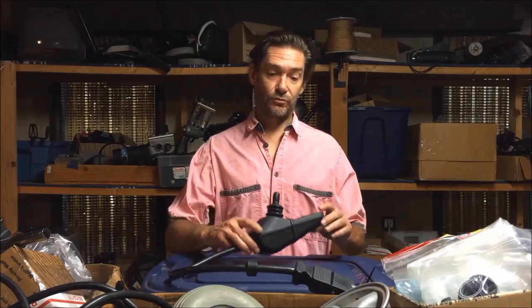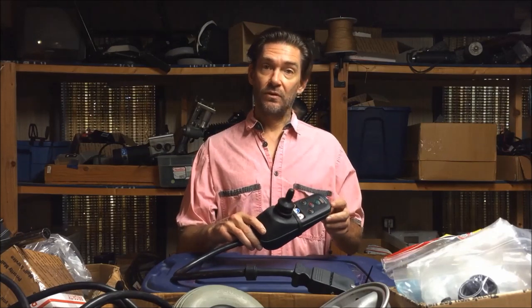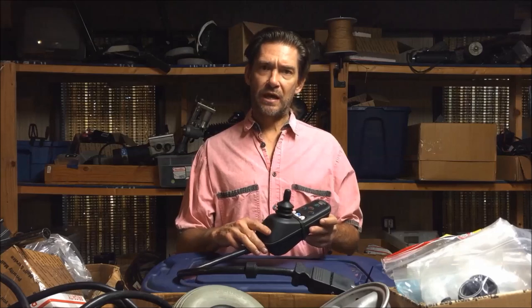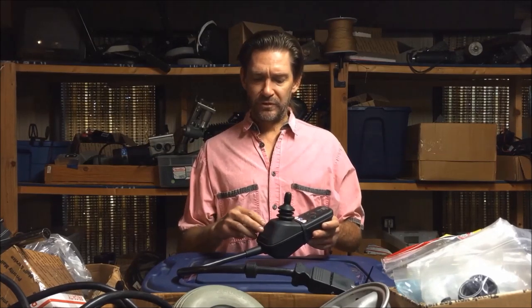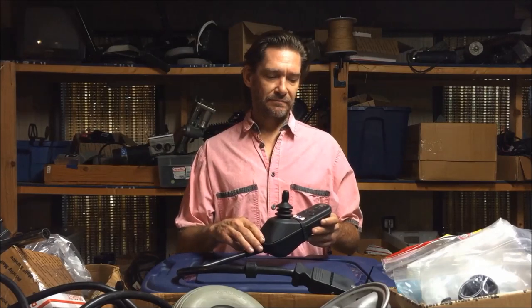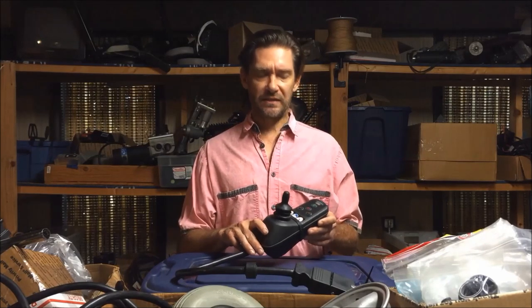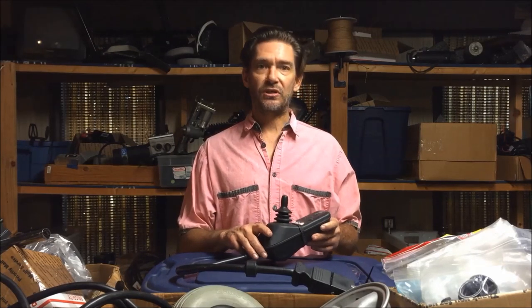Hey there, this is Frank with Electric Wheelchair Parts. I want to talk about VSI controllers. They're very popular joystick for many brands and models of electric wheelchairs out there. They're pretty reliable, pretty hardy. They do have their idiosyncrasies, but I can't really say it's always one thing that goes wrong, but I'll go through just a couple of them.